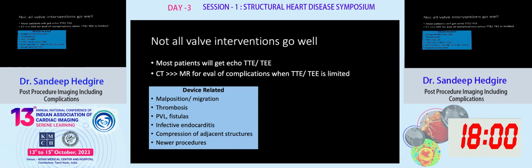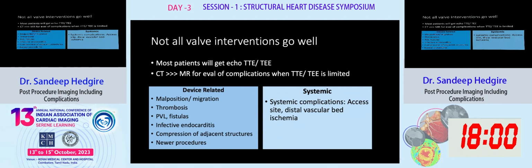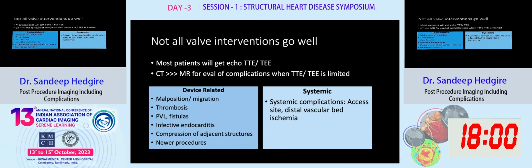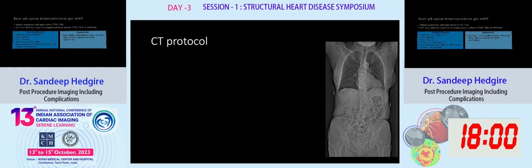Please know that not all valve interventions go as smoothly as Dr. Bala showed, so you will see plenty of examples in my talk about device-related or systemic complications of these interventions. These device-related complications include malpositions, migrations, thrombosis, paravalvular leaks, fistulas, infective endocarditis, compression of adjacent structures, and we'll talk about some newer procedures. Systemic complications are similar to any vascular access, particularly hematoma and pseudoaneurysm.